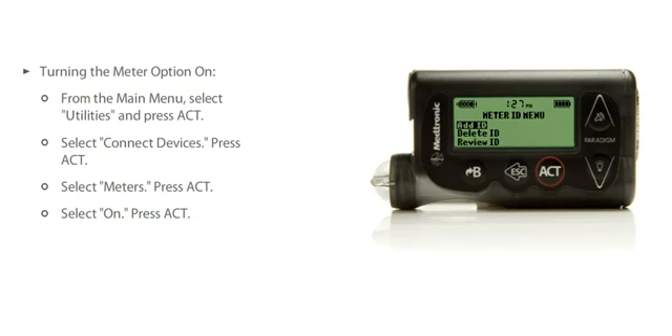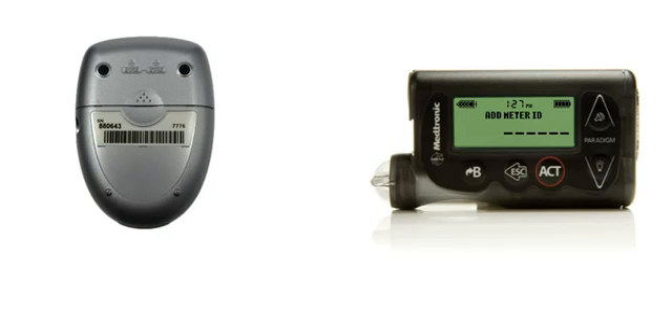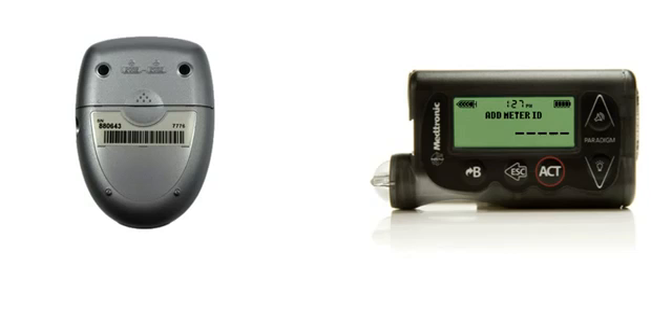The Meter ID menu will appear. Select Add ID and press Act. Each meter has its own unique ID. Look at the back of your meter to find the six-character ID. If you have difficulty locating the ID, consult the user guide that came with your ContourLink meter. Using the Up and Down buttons, enter each of the six ID characters. Press Act after each character.